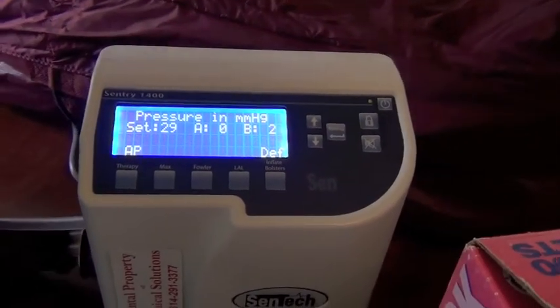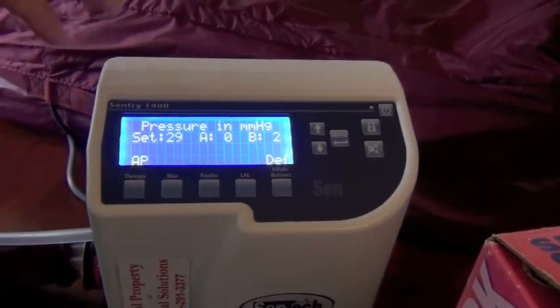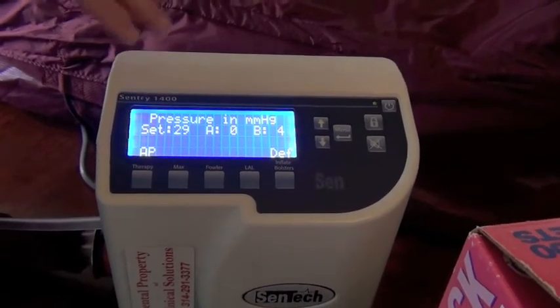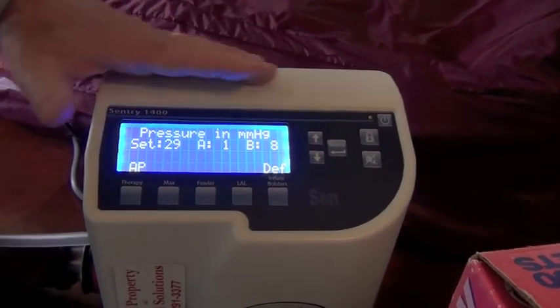whatever it was doing before, and it always gives priority, again, to these peripheral bolsters, which give the device, the mattress I should say, stability. So those will fill up before anything else does, and once they're full, then if there's any need to add air to the mattress, that follows.